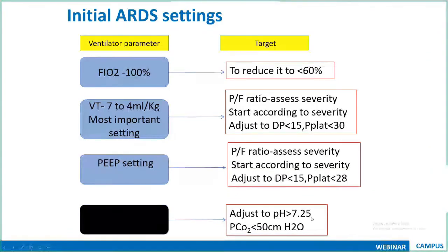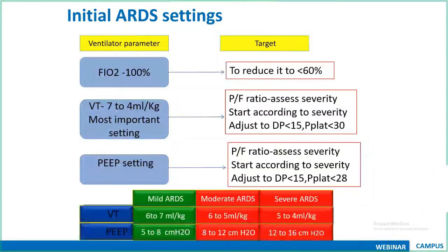How can we do that? You increase the respiratory rate. And PCO2, it is not always necessary to keep it less than 50. You don't have to worry much about the PCO2 values.